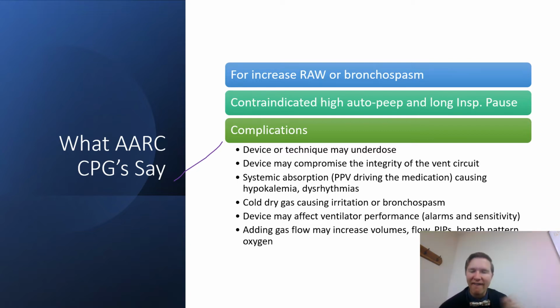Okay, you're like, I got it this time. So you shake it. You're getting ready, you're shaking the MDI, right? That's what I'm talking about by shaking it. Get your minds out of the gutter. You're ready for the next dose, so you're going to do the next puff. And then all of a sudden you see the ventilator start to deliver a breath, and then you start to, oh, I didn't have it seated the right way, but some of it got in there. Oops. So the medication and timing can be an issue. So you could easily underdose.